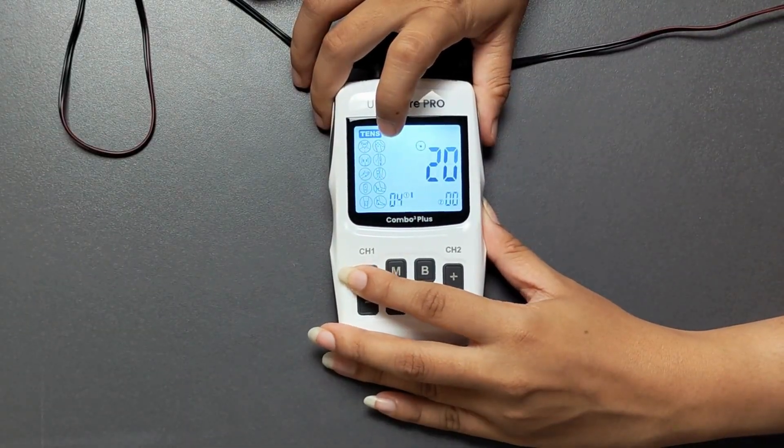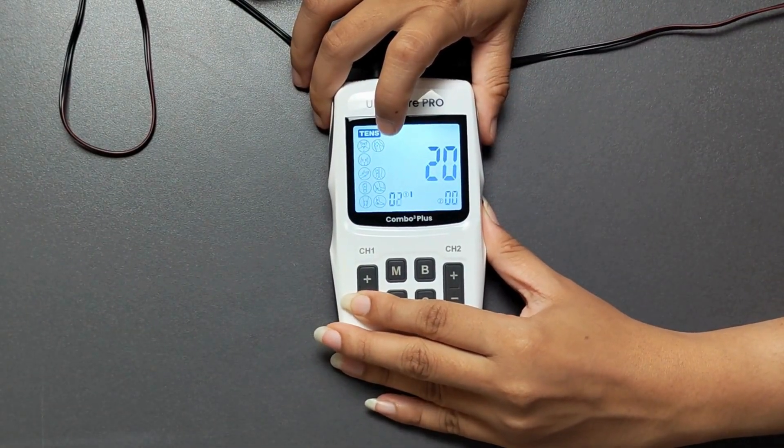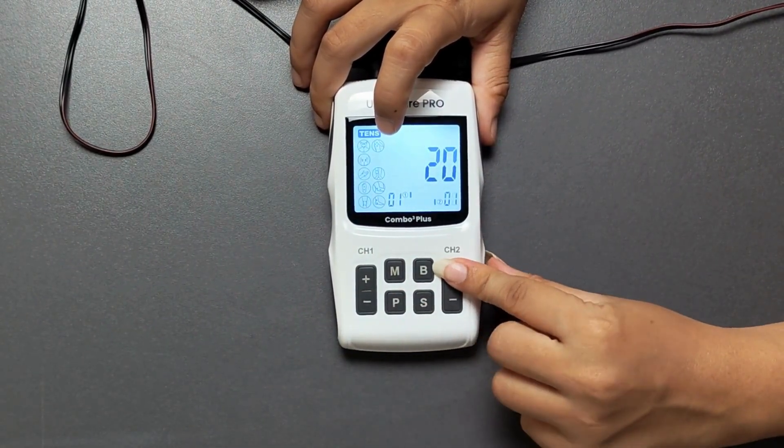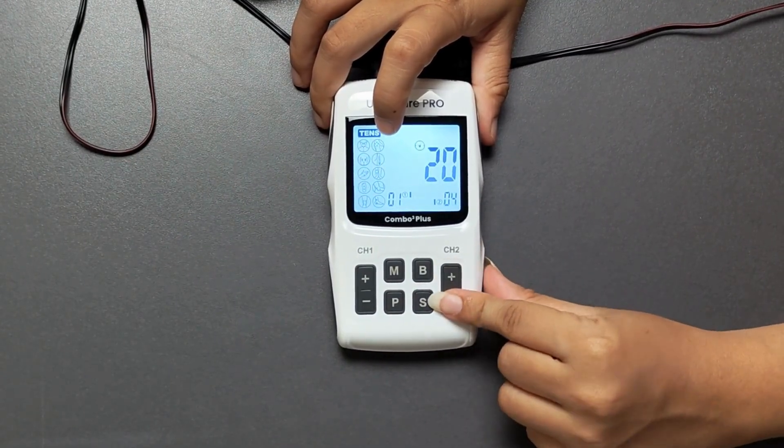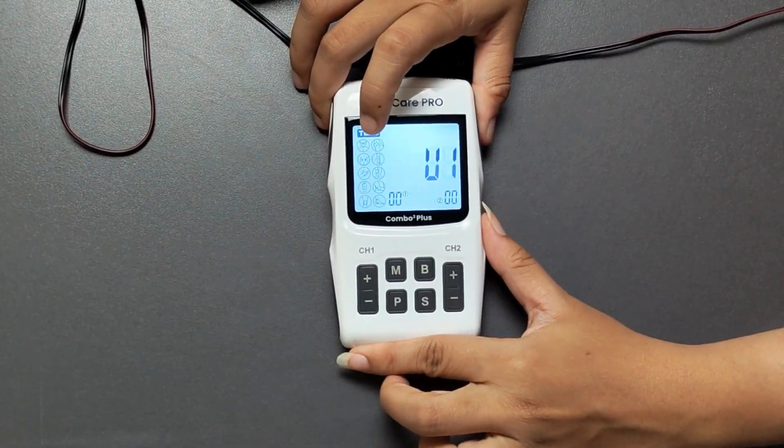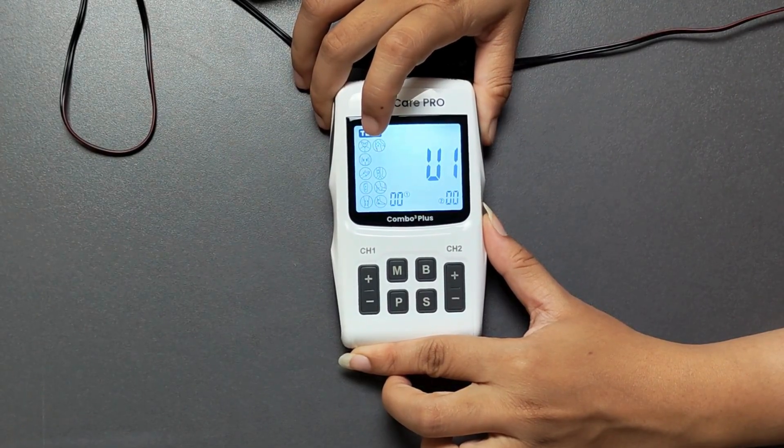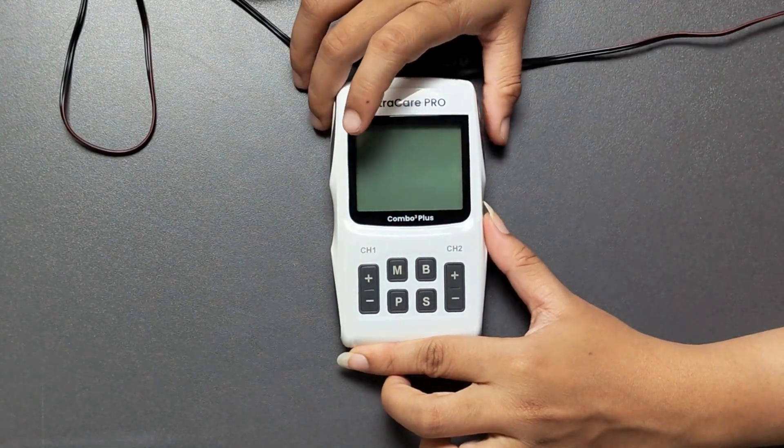Now adjust the intensities for channel 1 and channel 2 using plus and minus buttons. For TENS, EMS, and Russian current therapy, intensity can be set from 00 to 90, and for IFT, intensity can be set from 00 to 60.